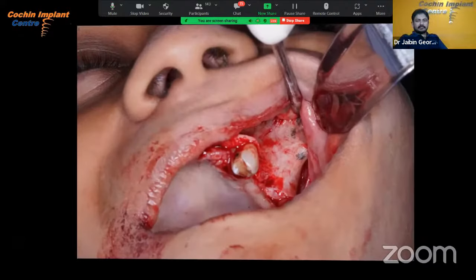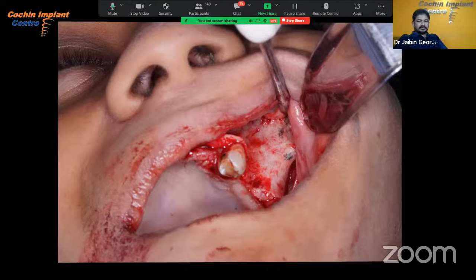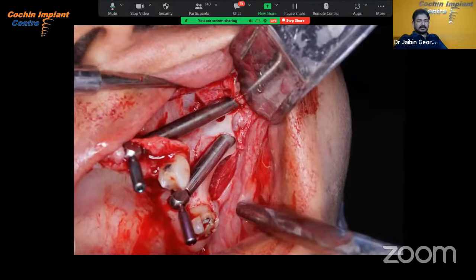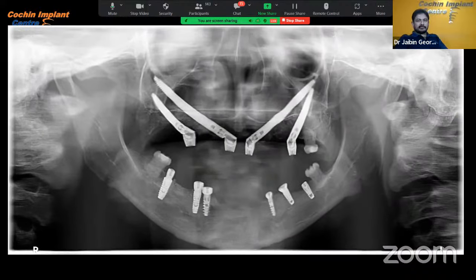And these are the intraoperative photographs. You can see the marks where we are going to enter into the zygoma. So the osteotomy, you can see the drills placed. These are the two zygomas with multi-units. 4 zygomas are placed. There is no bone to place any other implant.